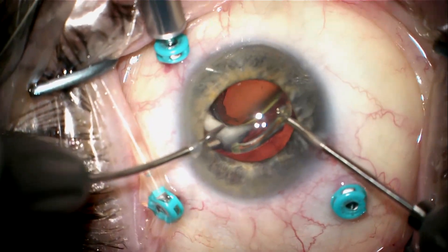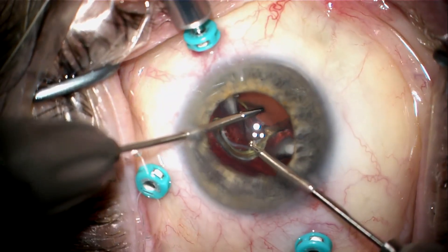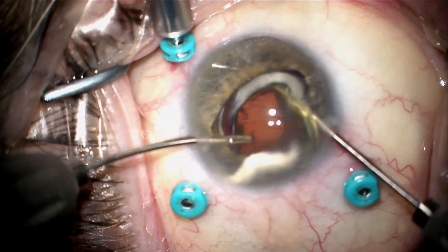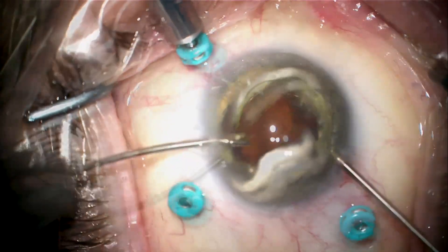I hand it over, hand-over-hand, to myself using another 23-gauge forceps to securely grasp the optic of the lens. Then I can dial the lens-bag complex along with all the capsular tension ring material into the anterior chamber completely.